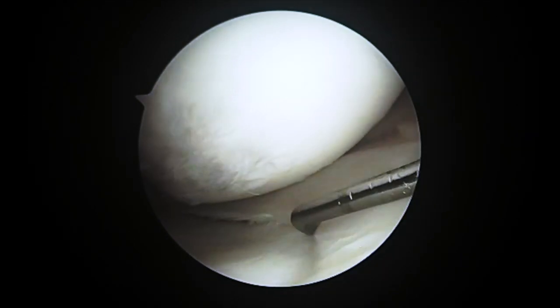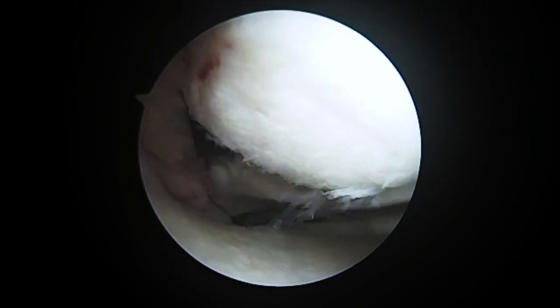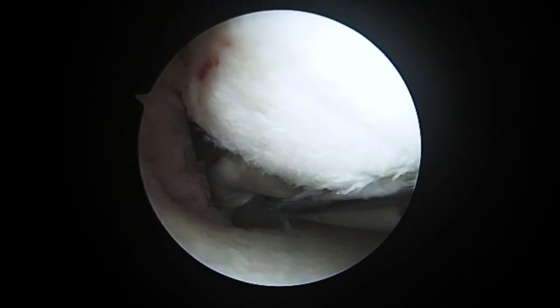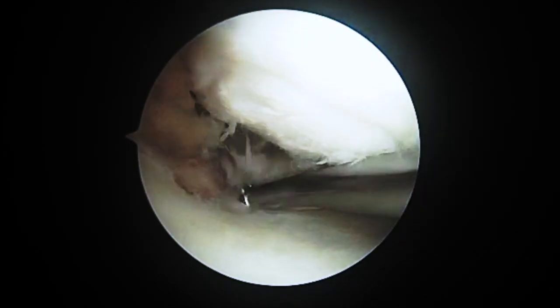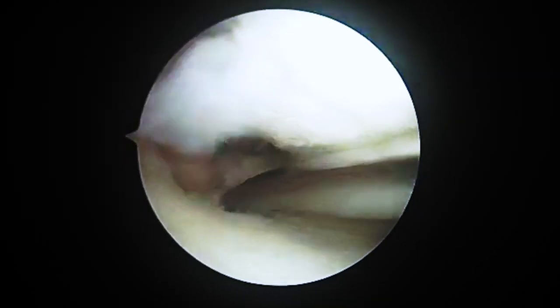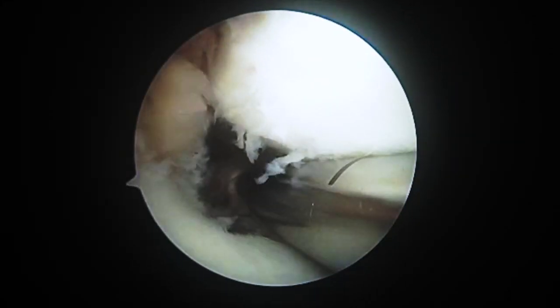A standard diagnostic arthroscopy is performed confirming the presence of a medial meniscus posterior root tear without significant medial compartment arthritis. The meniscal footprint was prepared on the tibial insertion using a curette, and a shaver was used to prepare the inferior edge of the meniscus as well as the tibial footprint.